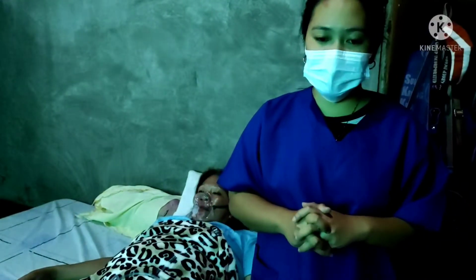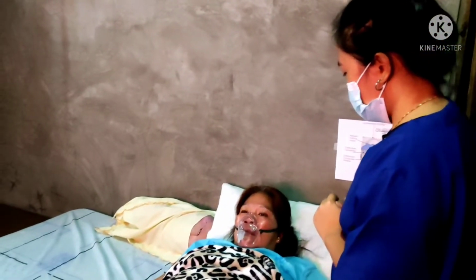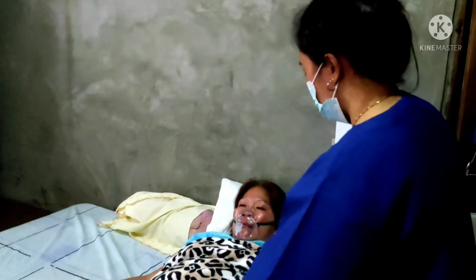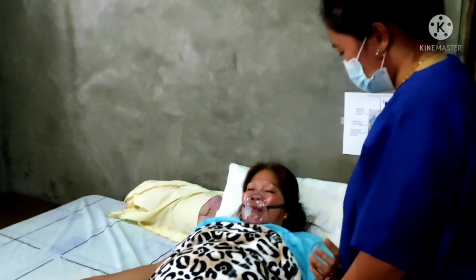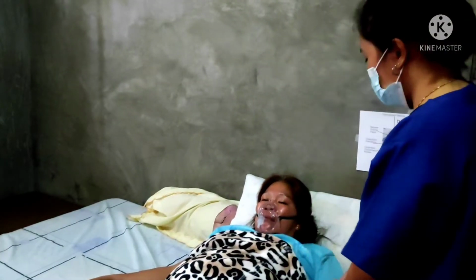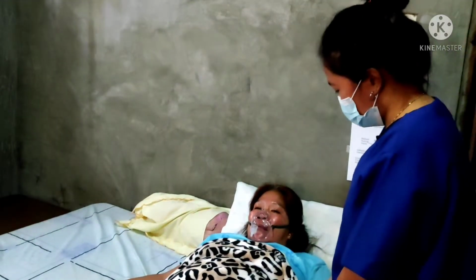Introduce yourself and explain the purpose and procedure to the patient and identify the patient. Providing information fosters the client's cooperation and allays his or her anxiety. So ma'am, I'm Gigi Velasco from Sasn, Quezon City, and I'm your student caregiver for today. So ma'am, can I ask your name and when is your birthday? Geraldine Velasco. March 17, 1972. Okay, thank you ma'am. So now I'm performing nasopharyngeal suctioning. So is that okay with you ma'am?